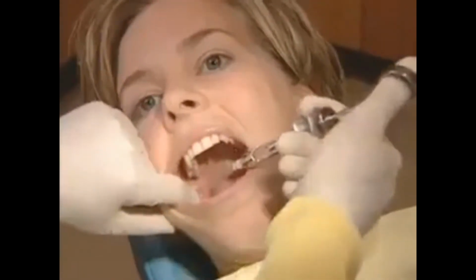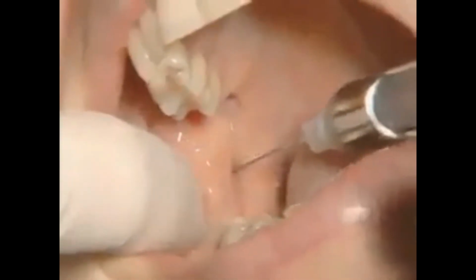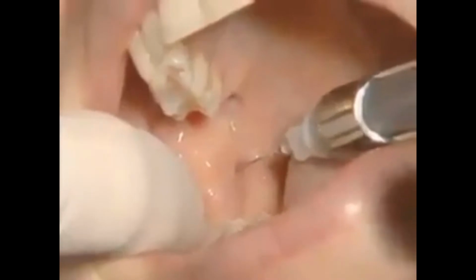After palpating the landmarks, you will be inserting the needle into the pterygotemporal depression. The needle is brought in from the contralateral side, and insertion point is directly there, and advance slowly until you go 25 millimeters.